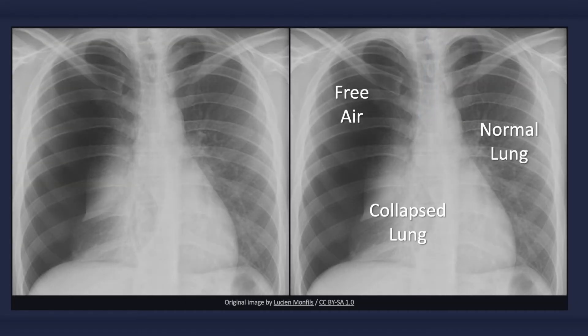Here is a more obvious x-ray of a pneumothorax. No lung markings are visible beyond the border of the right lung, which has collapsed. Notice the increased opacity of the collapsed right lung in comparison to the normal left lung. As well, the right heart border cannot be identified because the collapsed lung is indistinguishable from the heart. This is referred to as the silhouette sign.